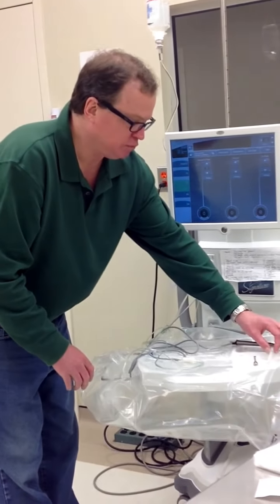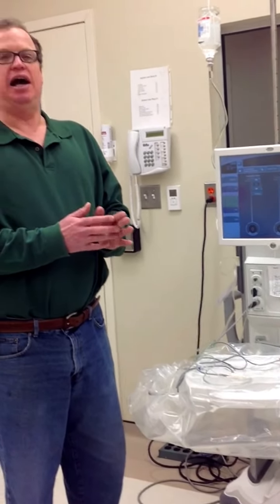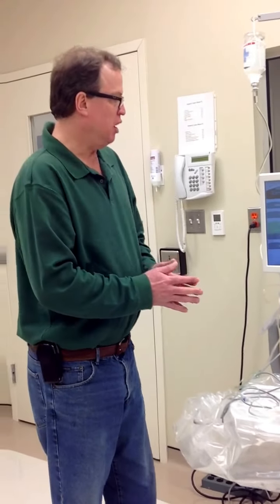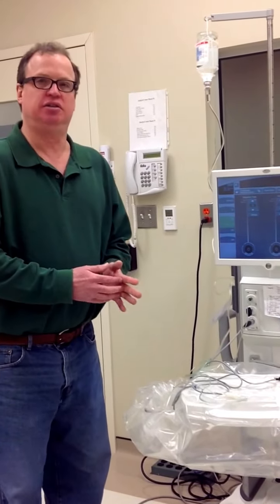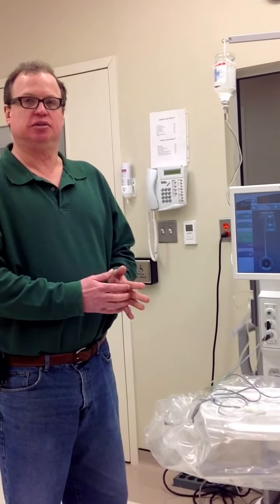Now, during the Vit Prime process, the machine aspirates and clears the vitrectomy tubing of air, which naturally it starts off with, and it also tests the blade, which you can feel when you're holding this in the cup. Now, in vitrectomy itself, there's two modes that are of great importance.